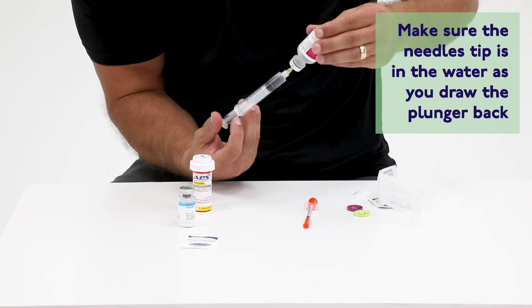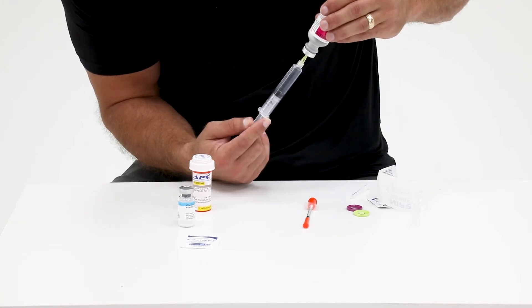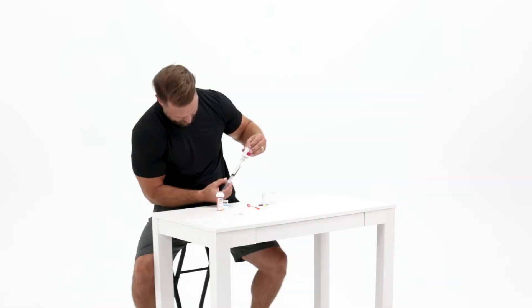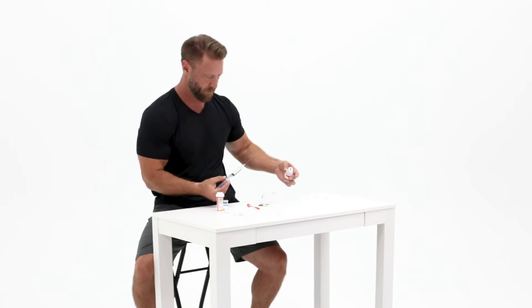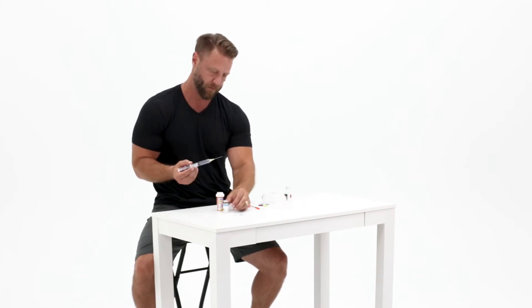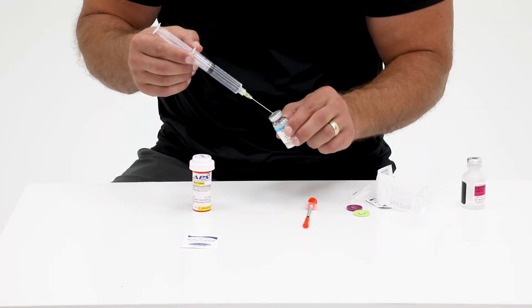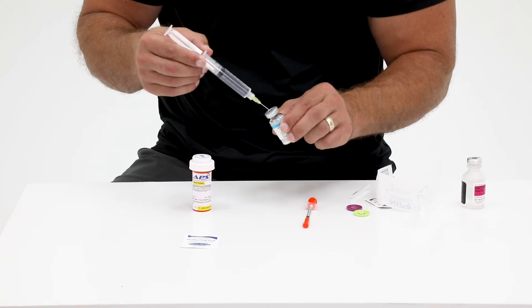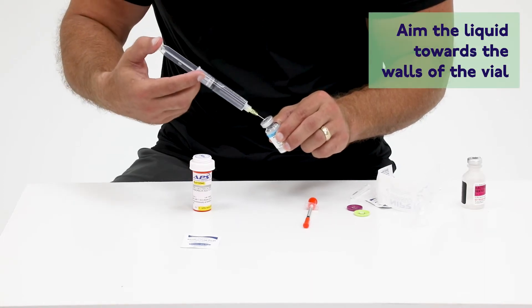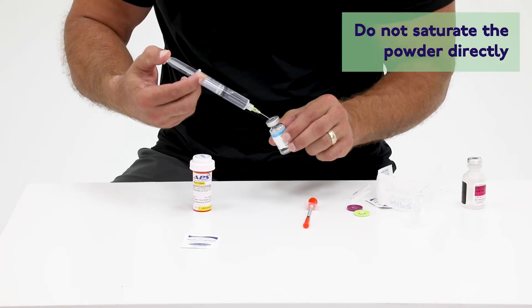Then you will pull back the plunger to transfer the prescribed amount of bacteriostatic water into the syringe. Now insert the syringe filled with the bacteriostatic water into the rubber stopper of the lyophilized powdered vial. Hold at a slight angle and slowly press down on the syringe to inject the bacteriostatic water into the vial.